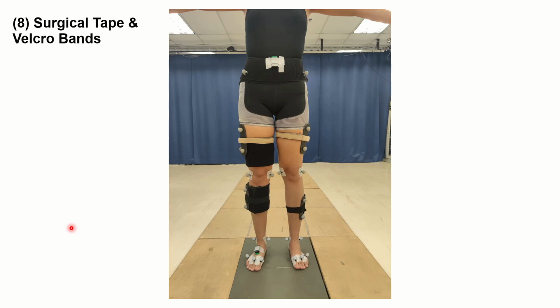And tip number 8 looks at the use of surgical tape and Velcro bands. So the tracking markers, that's the ones over here, don't have to be all that accurate, and they don't have to be symmetric, because they're just used to track the motion of that particular segment. So you can just slap them on with Velcro bands or just fix them to the body in whichever way you want. But the segment definition markers, like the ones at the knees, the ankles, or even ones at the toes, have to be placed at that exact bone segment or anatomical point. So I prefer to use surgical tape because it gives me a lot more control over where I place the marker and its orientation.